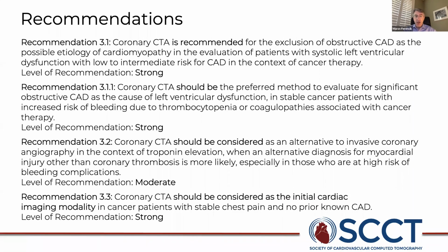Our recommendations for patients with possible cardiotoxicity are summarized here. Recommendation 3.1 is that we recommend coronary CTA for the exclusion of obstructive CAD as a possible etiology of cardiomyopathy in patients with LV dysfunction in the setting of cancer therapy. This is a strong recommendation.